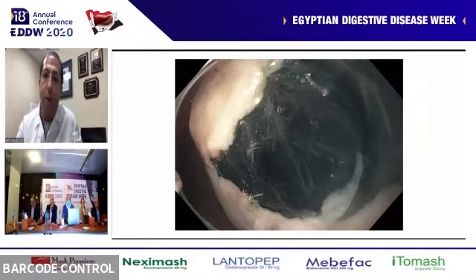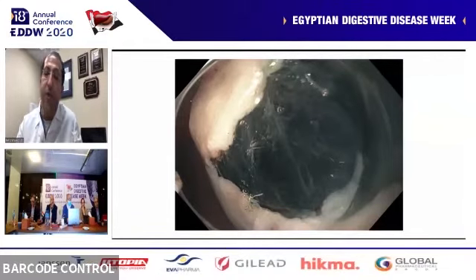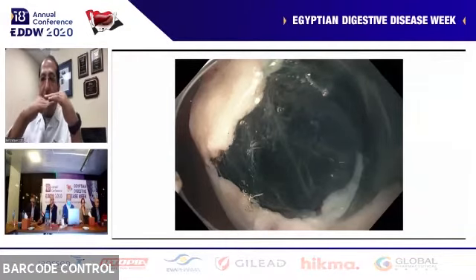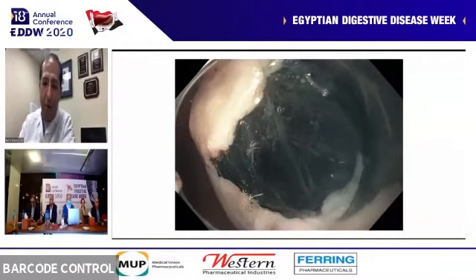So where does the word third space endoscopy come from? It comes from that slide that you're looking at, where you expand the submucosal space to create, quote unquote, third space to put your scope in. And I like to liken it to snorkeling. So mucosal resection is you swim on the surface. Submucosal dissection, you work in the submucosa, that's like snorkeling. Or, when you do a POEM, you're more like diving. You're closer to the muscle or floor of the ocean or the sea.